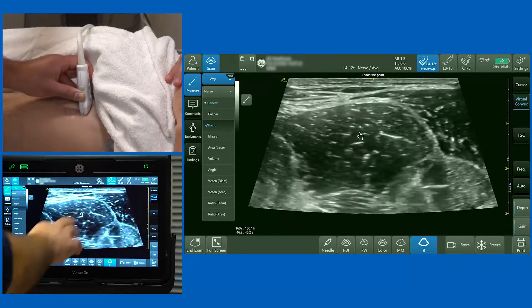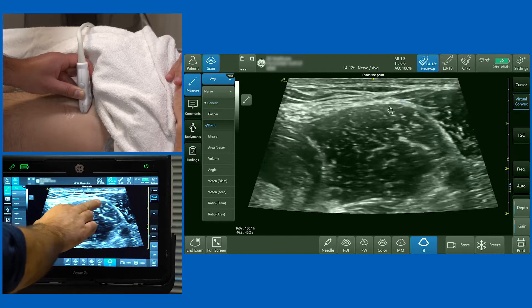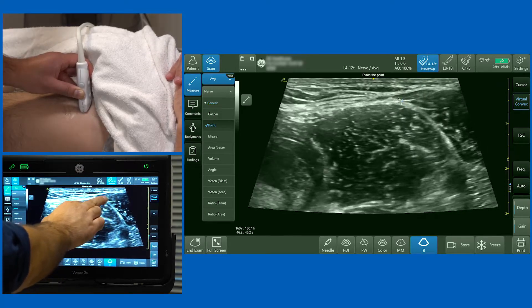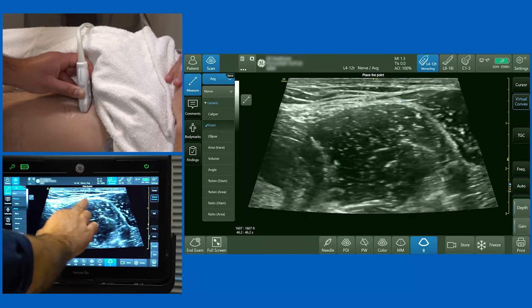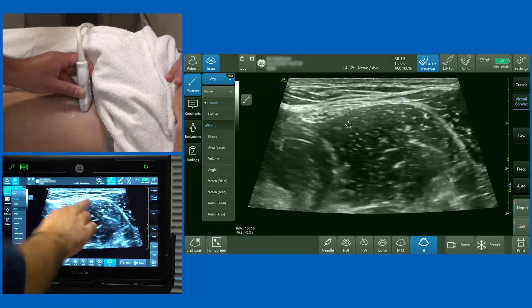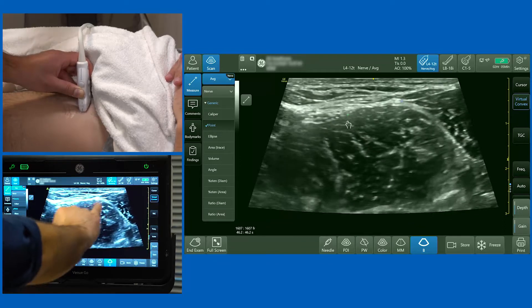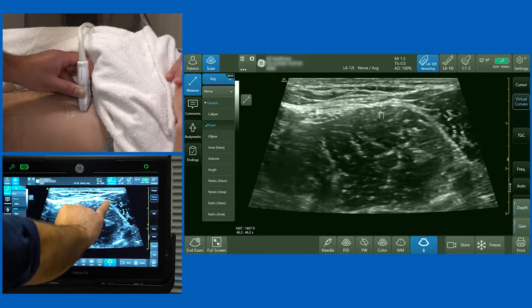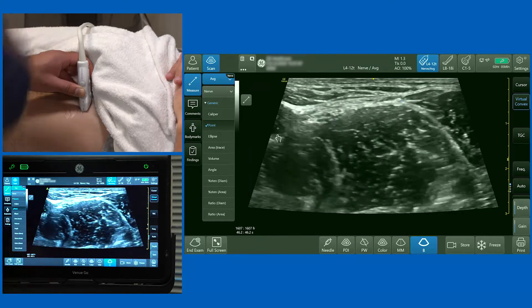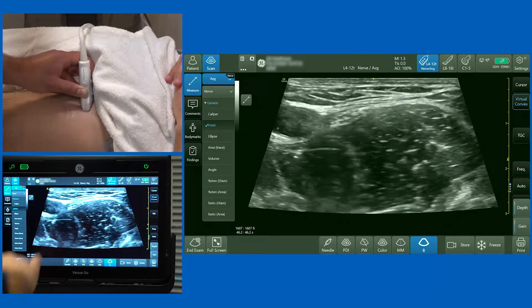As I slide the probe a little more laterally, I want you to appreciate another muscle. On the far right is sartorius, then iliopsoas, with the fascia lata and fascia iliaca above it. When performing the femoral nerve block, you generally bring your needle in from the lateral aspect, aiming from lateral underneath the fascia iliaca to surround the femoral nerve with local anesthetic.